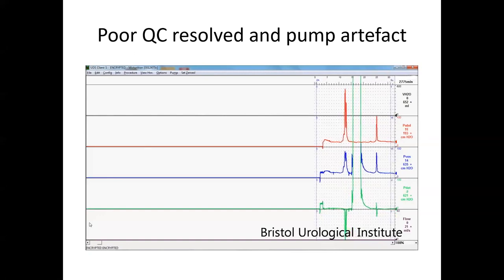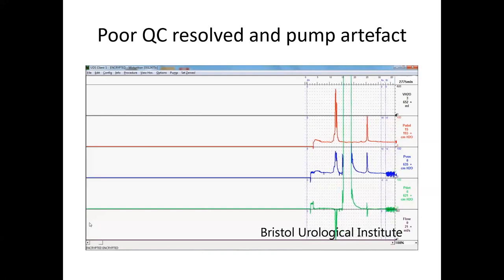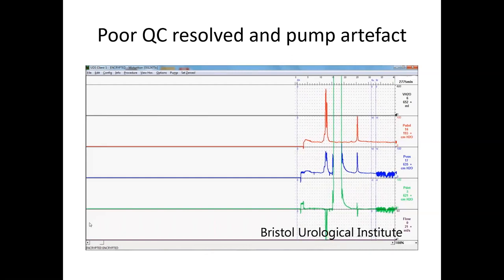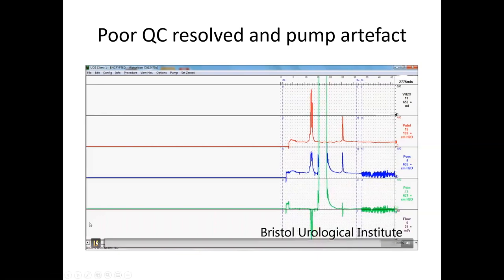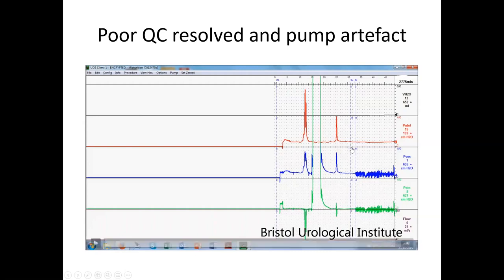And then as you start to fill your patient up, this is the pump artifact that you might get. Okay, so just to make you aware, this is what a pump artifact might look like. There's nothing you necessarily need to do. You just need to be aware that you want to stop every now and again and check your resting pressures that are sitting underneath that.